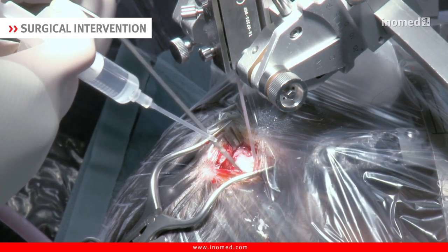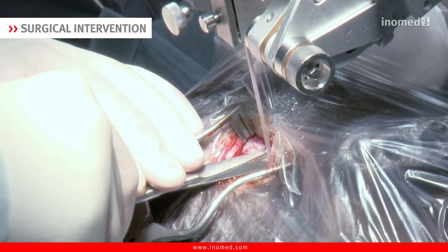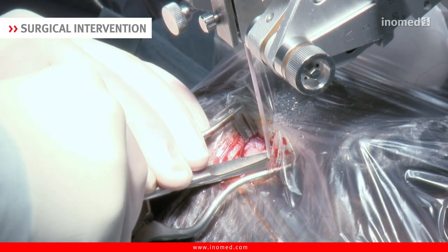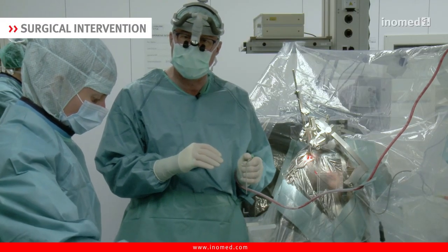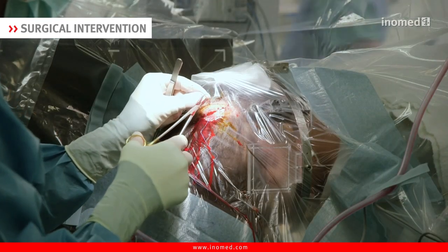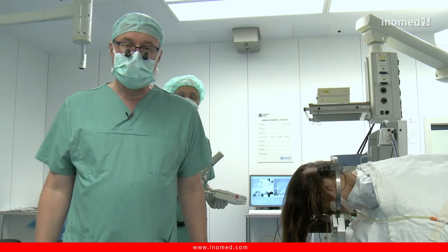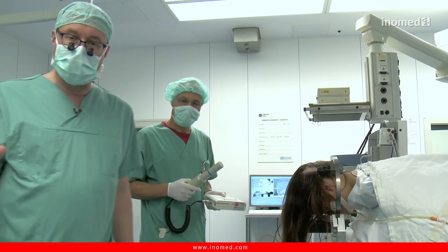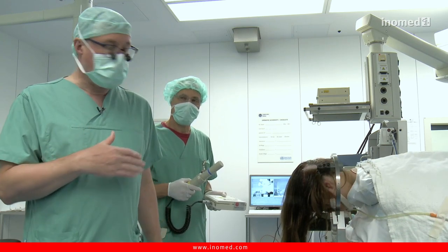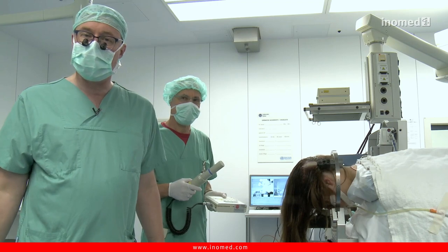The catheter is now framed with bone cement at drill hole level and secured with a clip to prevent it from slipping into the depth. Then we wait until the bone cement has cooled down. Next we cut the part of the catheter that protrudes from the hole and then we can suture. This concludes the procedure. The X-ray confirmed the catheter is in the correct position; meanwhile the catheter has been cemented and the wound has been closed.